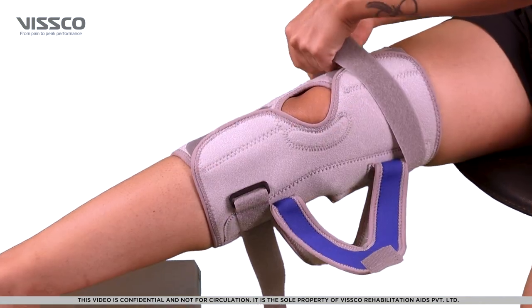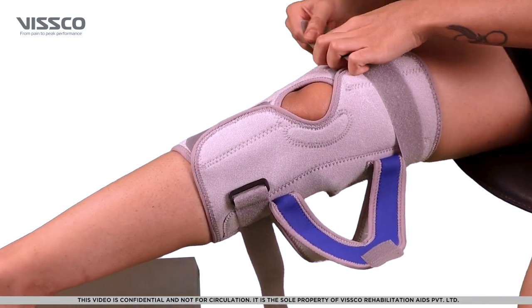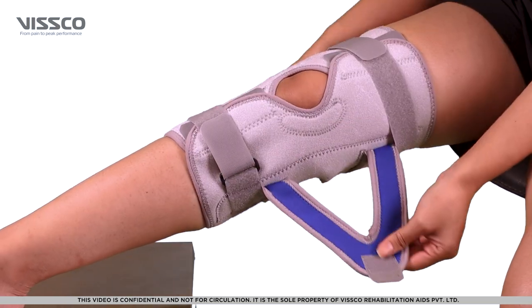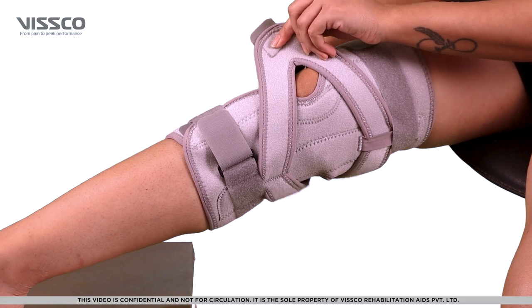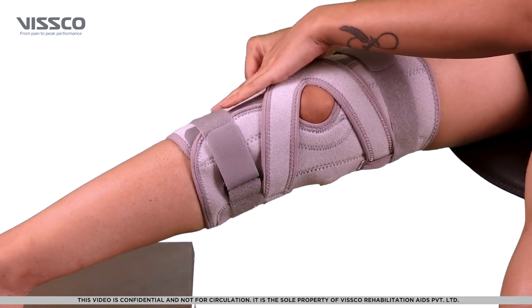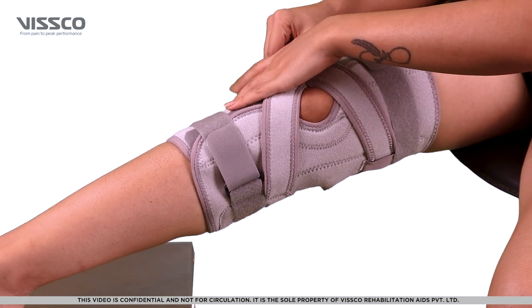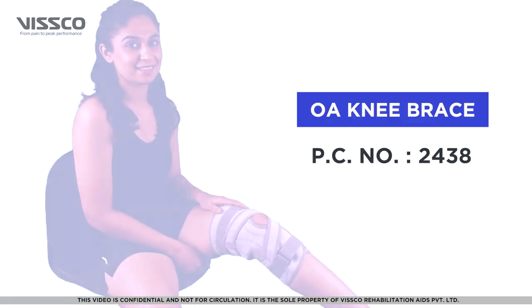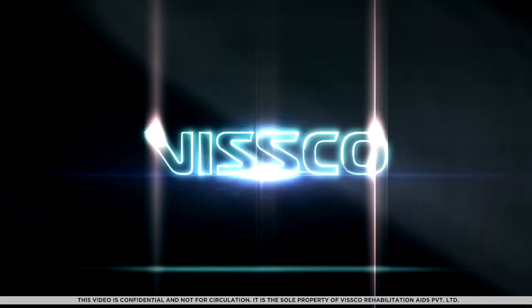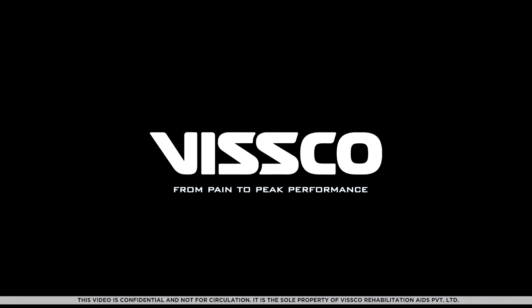Now lock the top and bottom straps one by one. Lastly, pull the diagonal straps and lock it to offload the medial compartment of the knee. Congratulations! You are now wearing the product correctly.